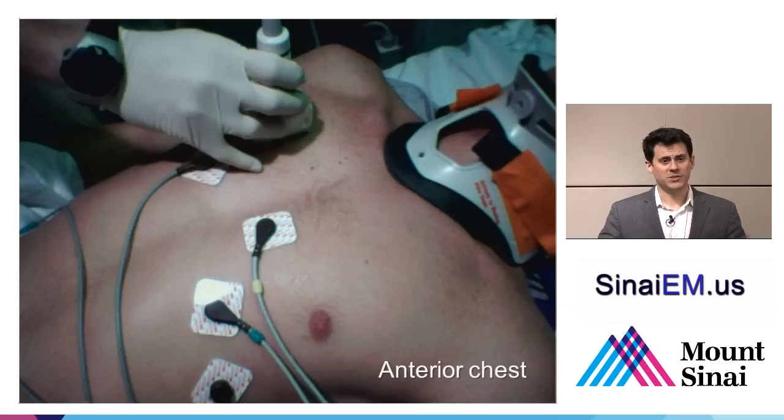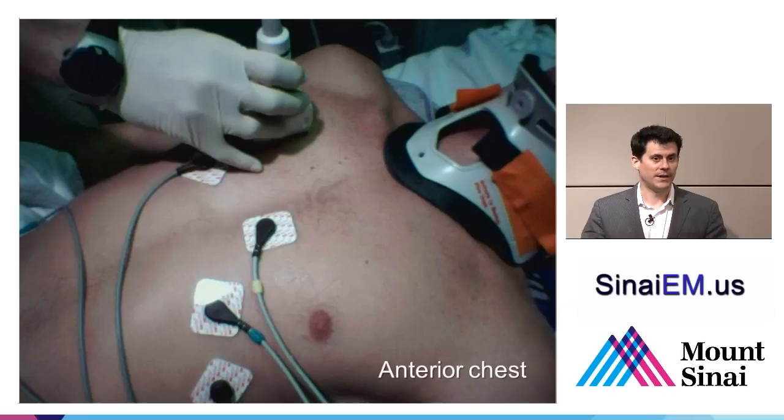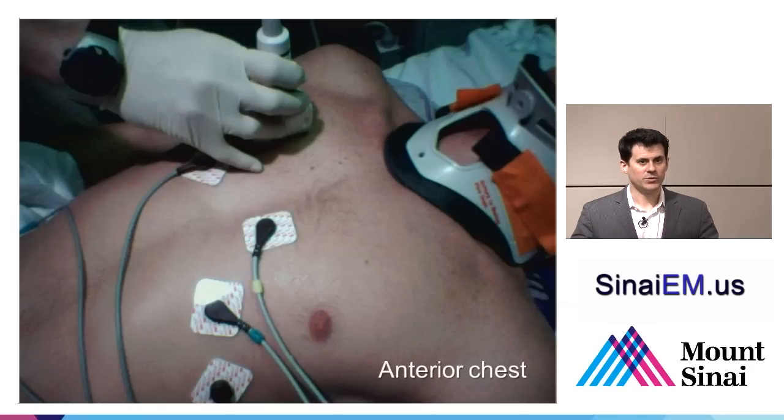But assuming a patient with normal, healthy lung tissue, assessing whether they have a pneumothorax, if they're supine, just has to do with looking at the most anterior aspect of the lung. So here we see probably somewhere between the second and fourth intercostal space, right around the midclavicular line, and you hold the probe with the probe marker facing up towards the patient's head.